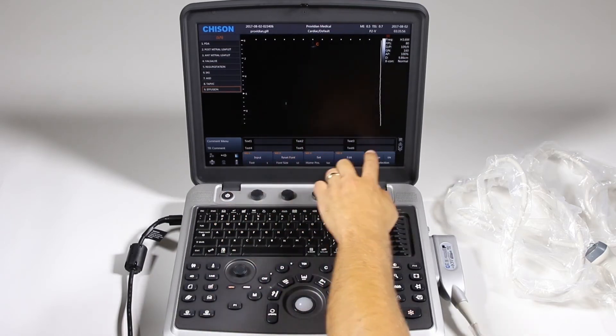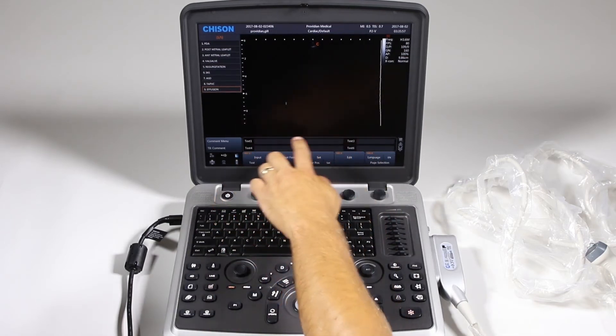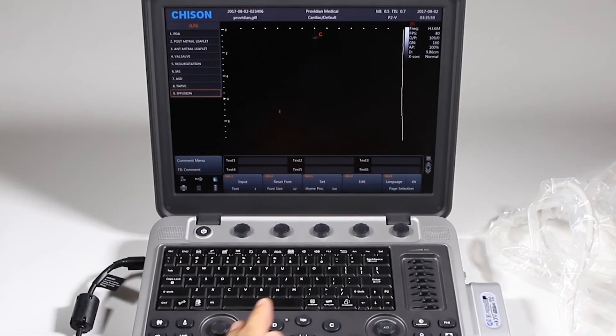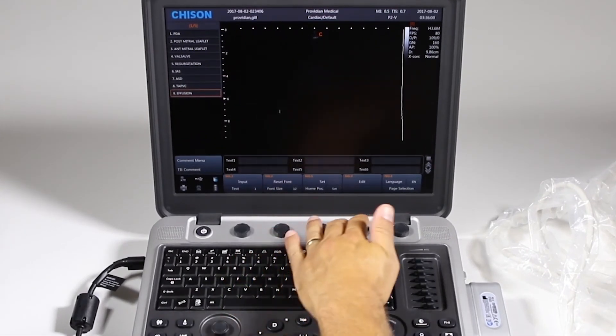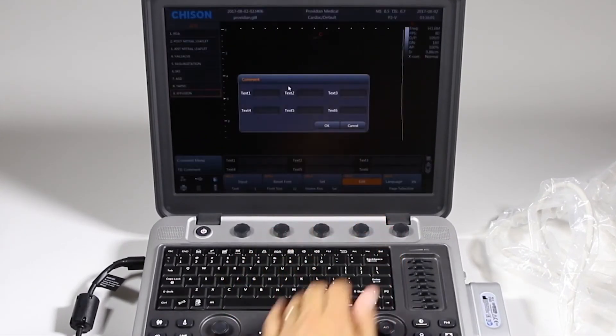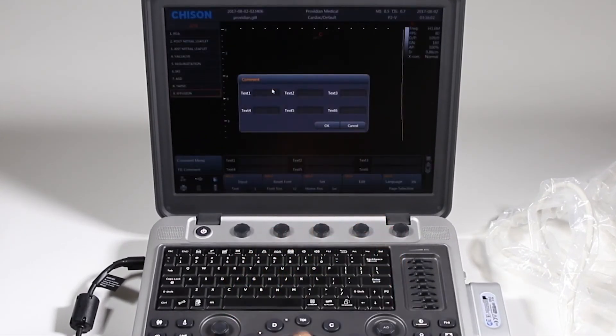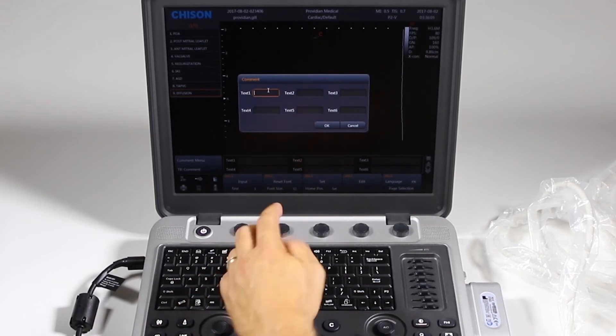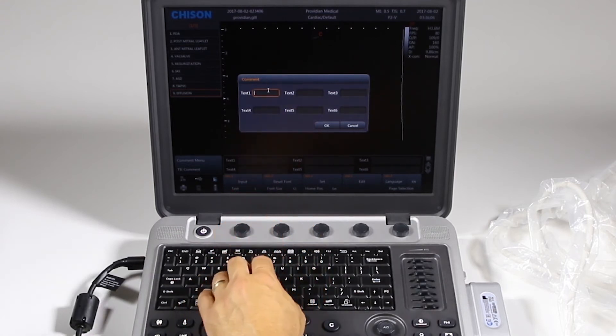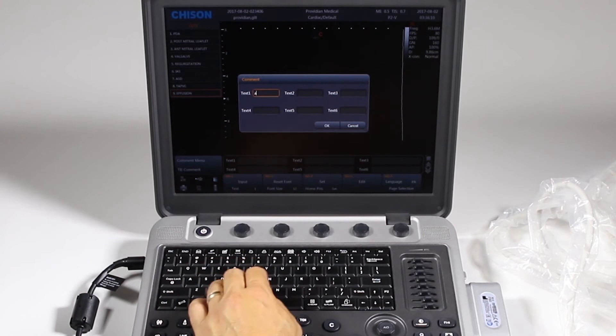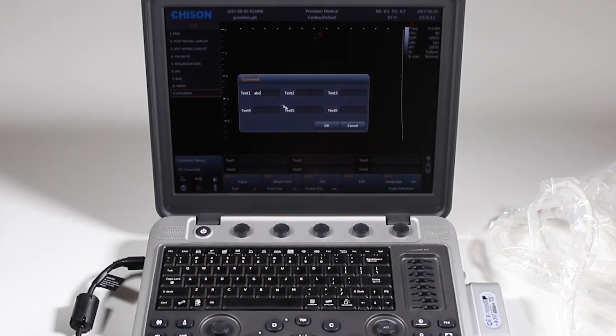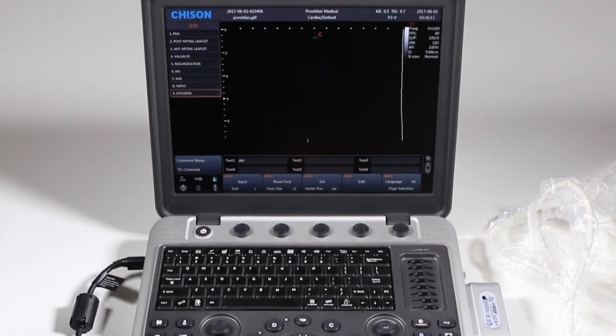Now you also notice there are a bunch of text boxes down here. These are quick text keys where you can click edit and type in your own auto text. So if you use the same thing over and over again, you prefer to use your own, you can type in, go with ABC and click OK.